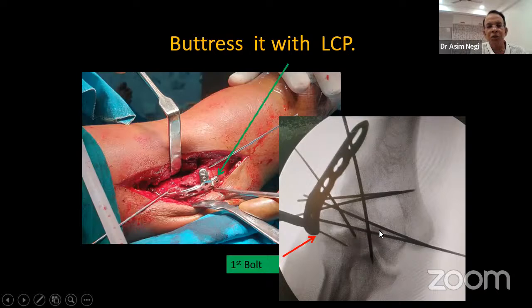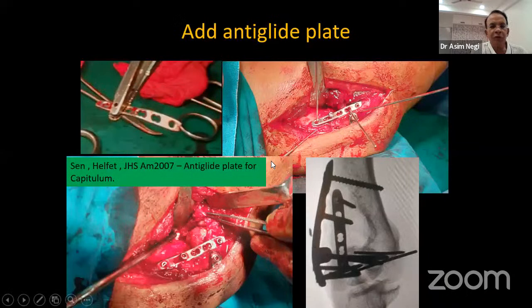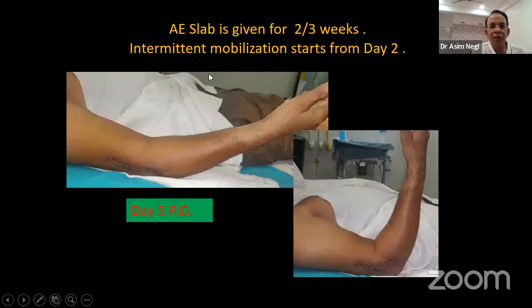Then an anti-glide plate was added. This Helfet paper showed that it's an extremely effective way of strengthening the fixation in this area. This is how it looks on the AP. And again, a slab for about 2 weeks, intermittent mobilization from next day. This is day 5, wound has settled. He has got so much of range. And at 3 months, the fracture has healed and he has got a full recovery of function.